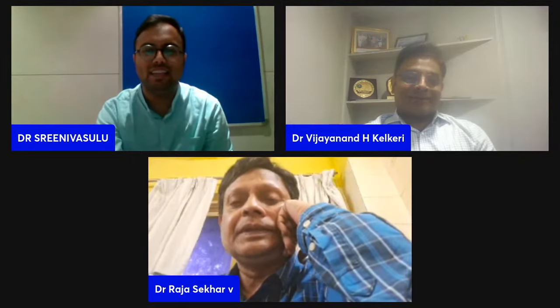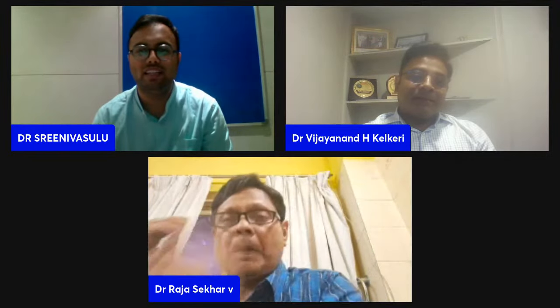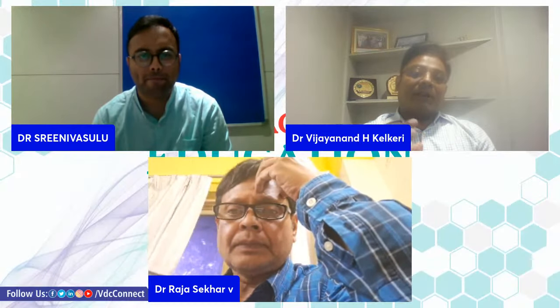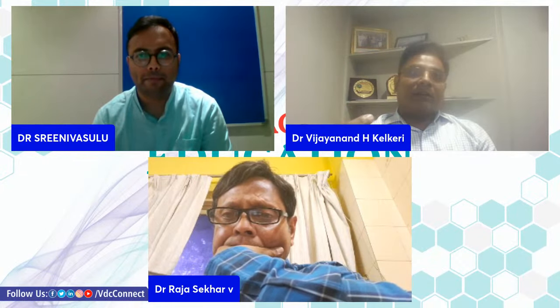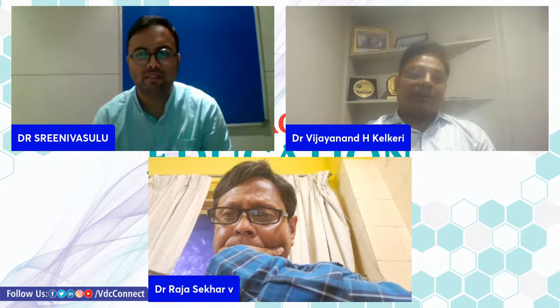Yeah, thank you. Sir, I have a small doubt. Is contrast really necessary in all the cases? Whenever there is a doubt, if we see small areas of heterogeneous signal which we feel can be osteomyelitis, because osteomyelitis sometimes can be really subtle.